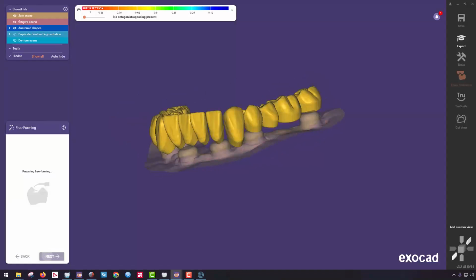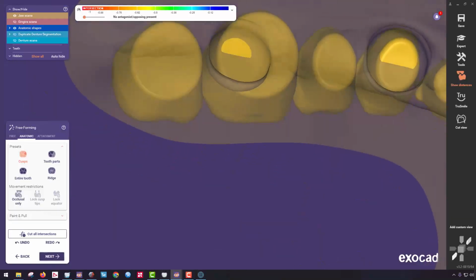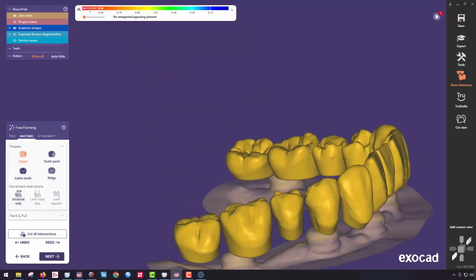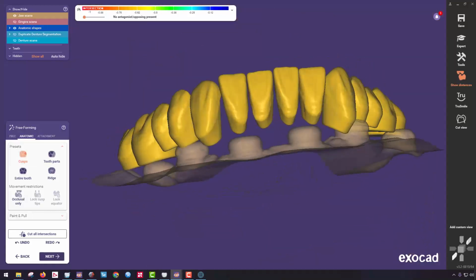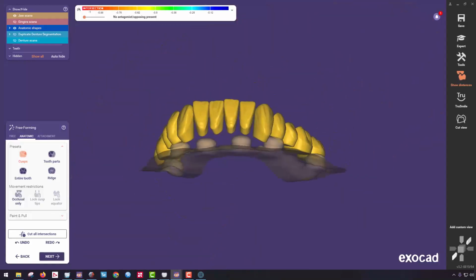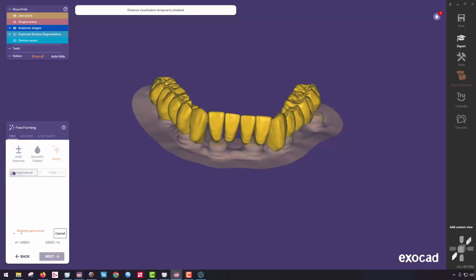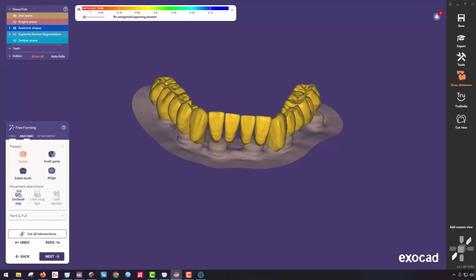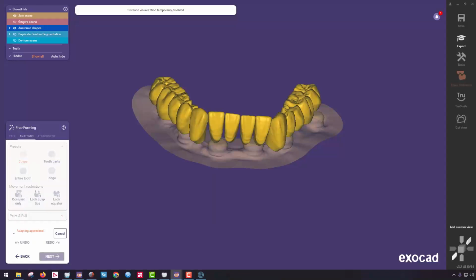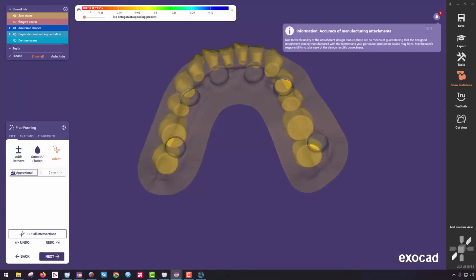Hit the next button. Because now here's where I want to spend a little bit of time verifying that I don't have any areas of contact. Like right in here, I see there's a little bit of some poking through where the scan body geometry is sticking through. So anywhere that I see the intersections, I want to either sculpt it or do an automatic. So like right in here, I can click on the free, adapt, and then go to the proximal, double check that my proximal. And then right in here, the anatomic, let's go ahead and cut all intersections. No problem. Attachment, everything here looks pretty good.